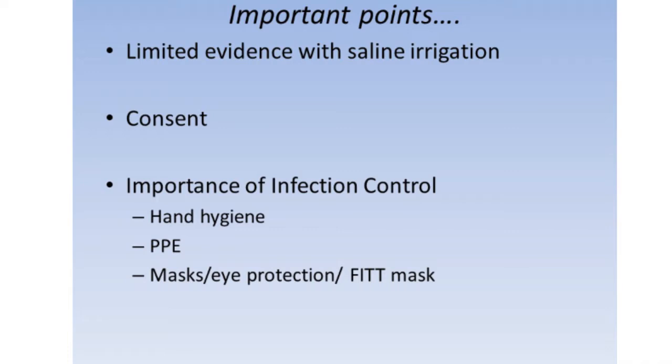So some important points about suction then. So limited evidence with saline irrigation. Consider clinical rationale as to why you want to use. Saline and mucus do not mix, and the saline does not disperse any further than main stem bronchi. Consent is very important. If patient can in any way communicate, informed consents need to be sought. Consent forms to be completed as per CSP guidelines. Always inform patient of proposed procedure, whatever their consciousness level.